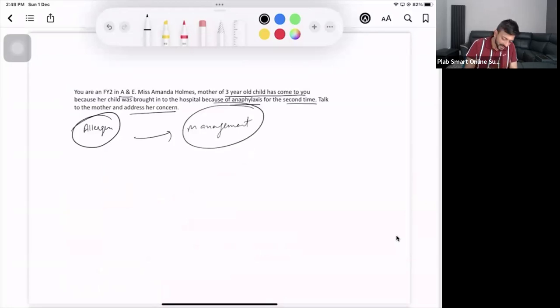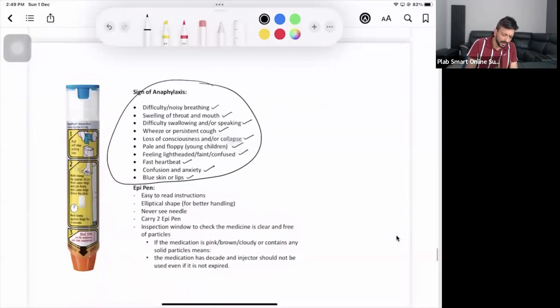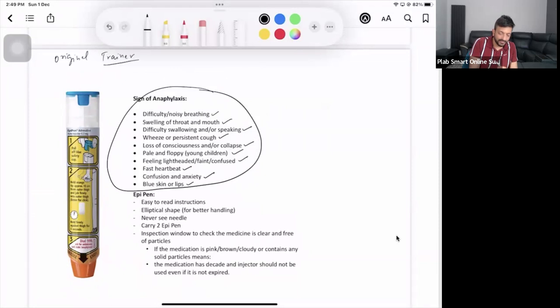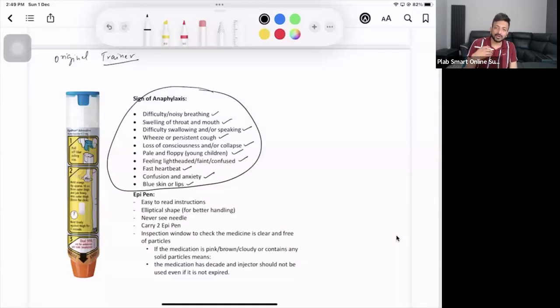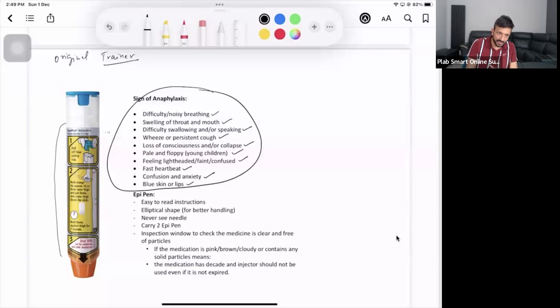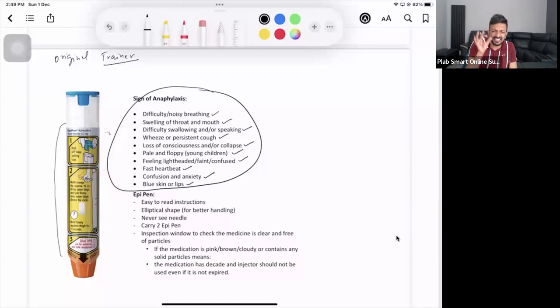So EpiPen, this is your EpiPen. You can have the original pen, but mainly you will see they will be giving you an EpiPen trainer. If they give an EpiPen trainer you can demonstrate it. If they give the original, please do not demonstrate it. But mostly they have got lots of EpiPens in the cubicle which are trainers. How it is explained, you don't need to worry about anything because the explanation is written on this.